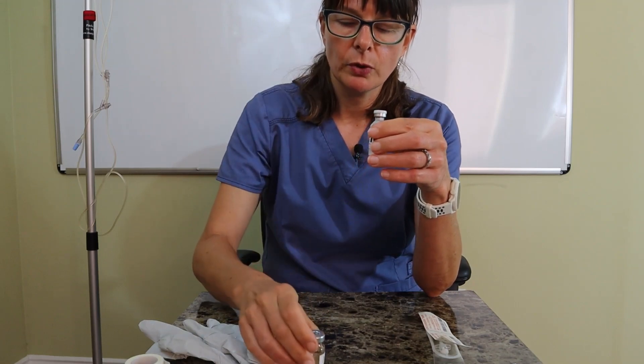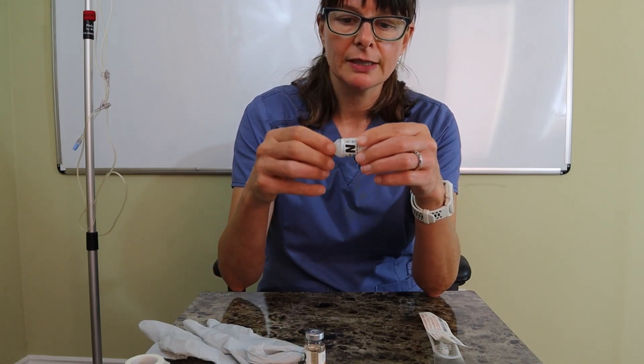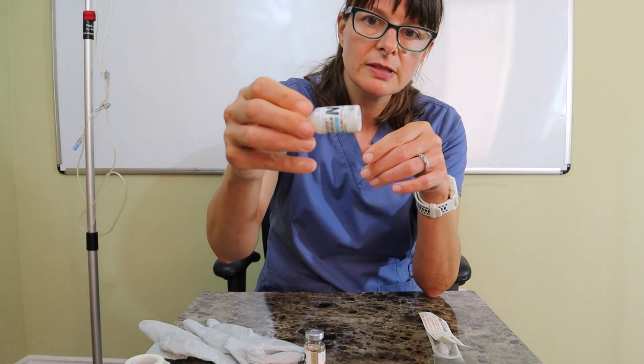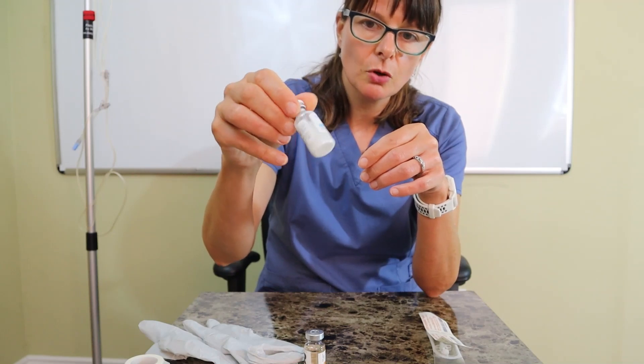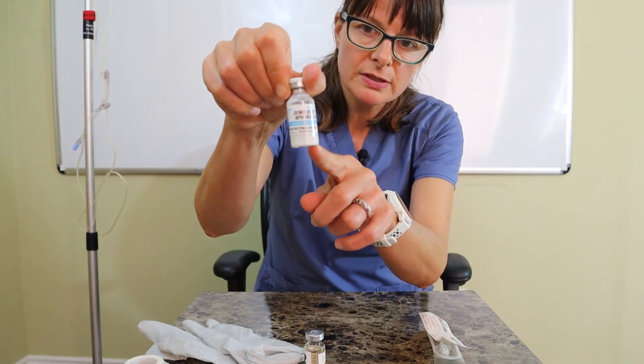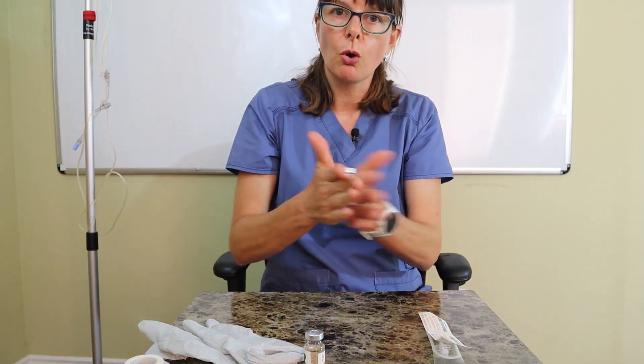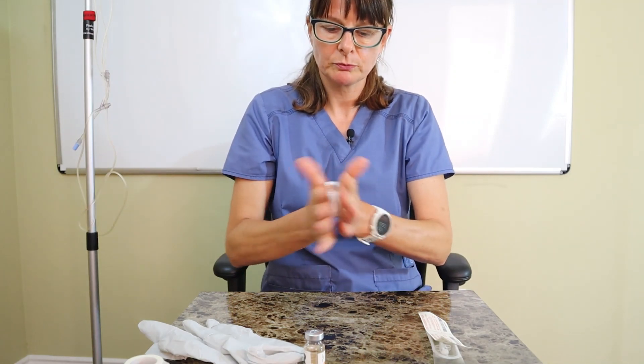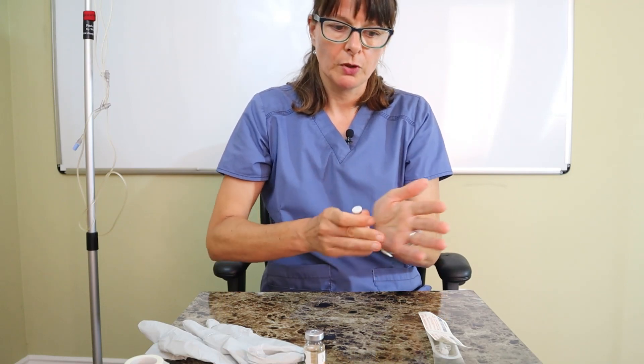Regular insulin is clear — we also refer to it as clear insulin — and NPH is cloudy. This here is a demo dose, but it's very similar to actual insulin. As you can see, there's some precipitation on the bottom, so I want to make sure I roll the vial first to mix it up. You don't want to shake it because that might create air bubbles, which are not easy to remove from an insulin syringe.